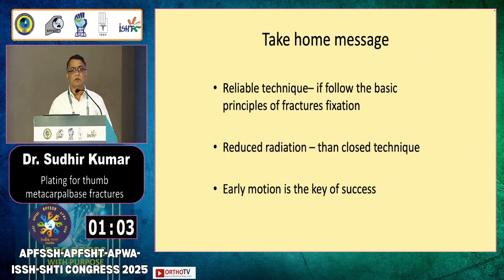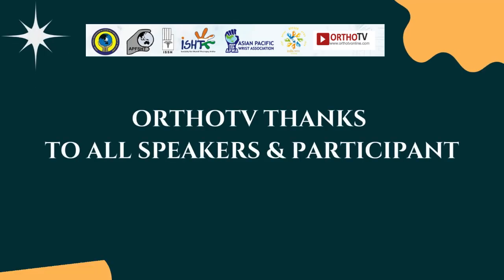One should be very careful at the time of dissection of the tendons around the metacarpal and phalanges. One should take care of the paratenon and try to put the plate strictly subperiosteally. Then only are you going to get a good function. If you are going to injure it at all, try to repair it back with thin sutures.